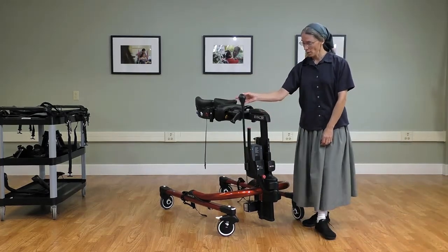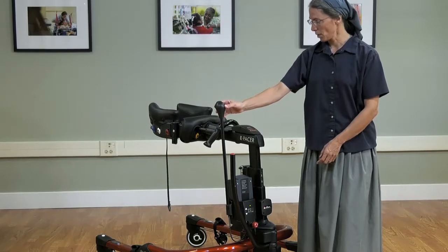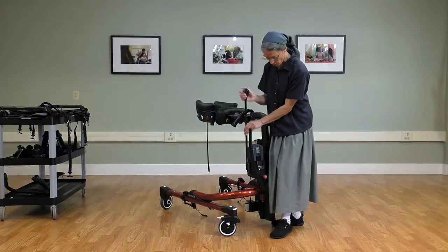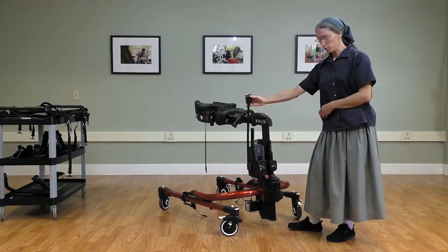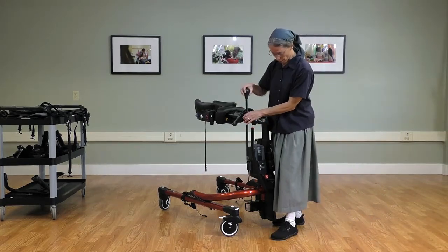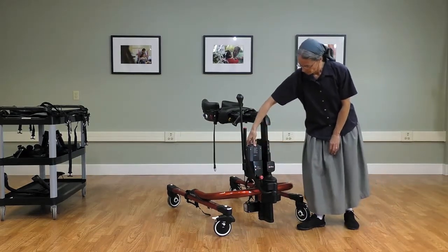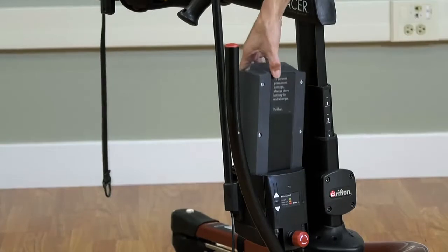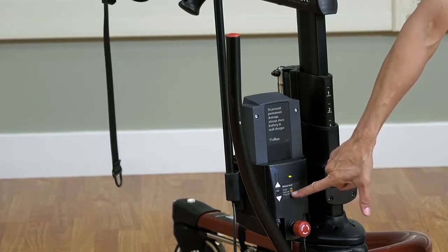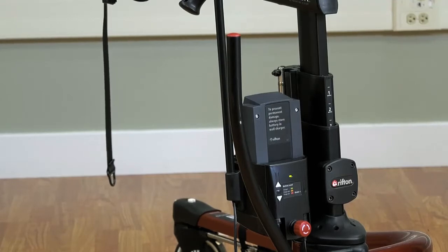Some newer features to point out: the switch pole, which will elevate and lower the body support system. You can actually turn this so that it is in easy reach of the caregiver or the client, depending on how you would like to use that. We also have a new battery housing — this is the battery — and there's an indicator light: green means ready to go, orange and red signify that you should recharge the battery.